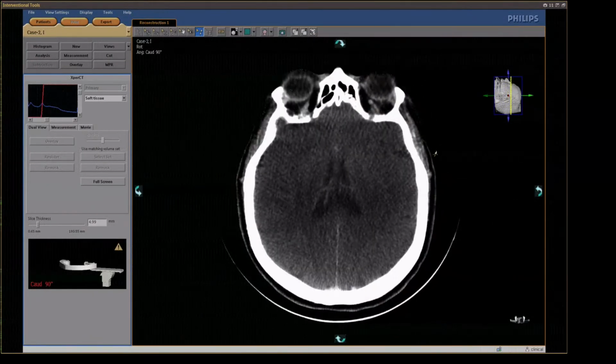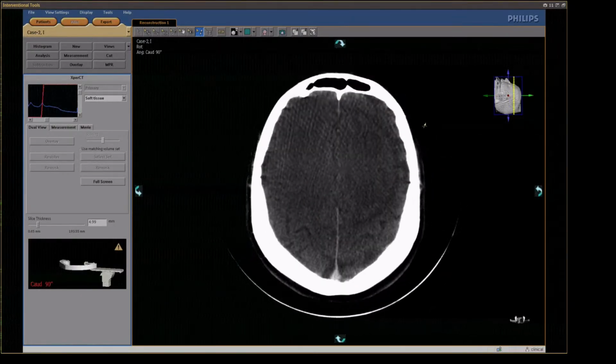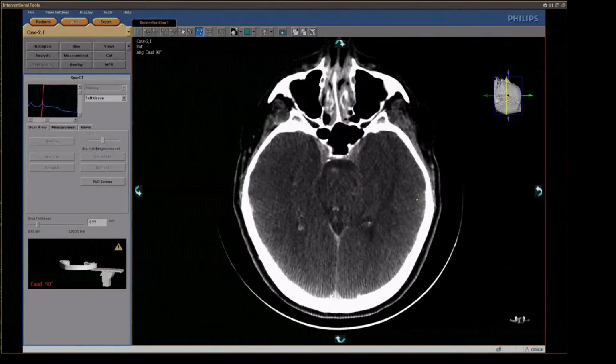Okay, dear colleagues, the brain is clear, and now we can finish this case.